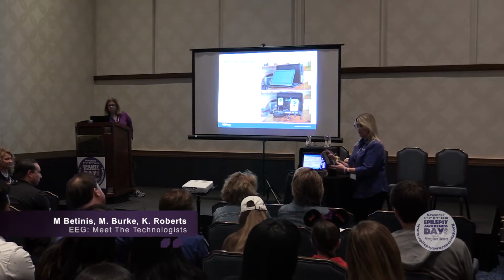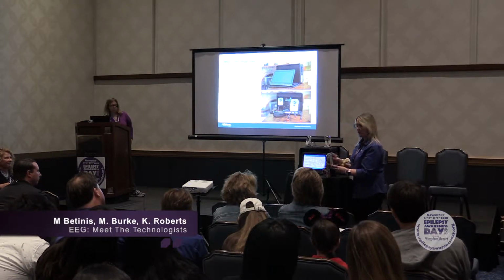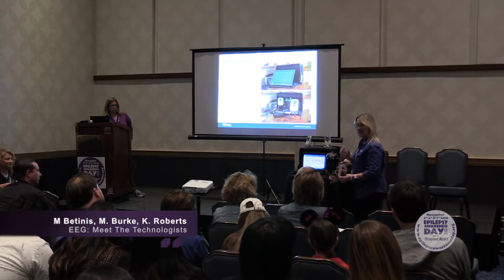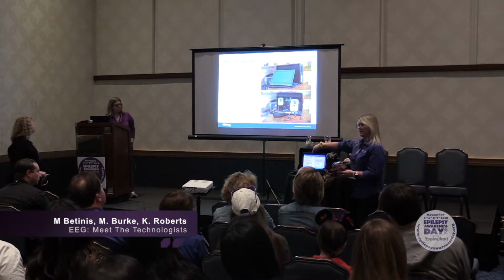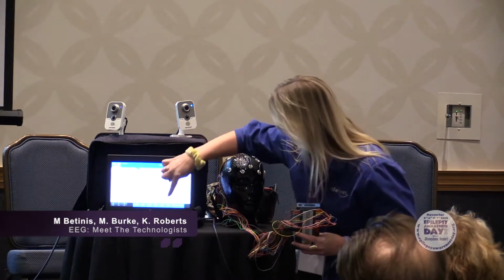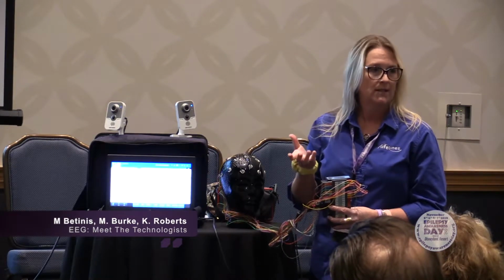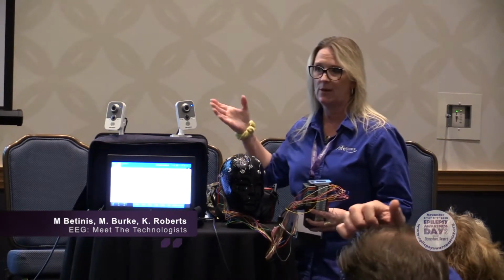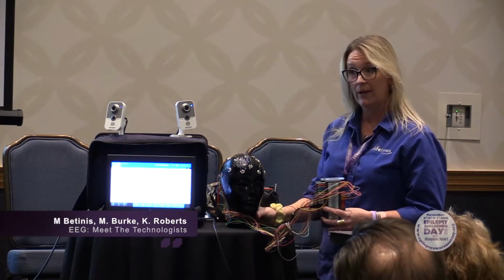This is our ambulatory recorder. It's quite popular and very well known for probably the past 18 to 20 years in EEG, which is pretty long. And you would wear this either on your hip or in a little backpack. And let's say you have an episode. There's a button here that you press, and it'll mark it right on the EEG. The other thing that a parent or the patient can even do is they can annotate just by touching the screen what their symptoms may be, or that they're going to sleep, or they woke up in the middle of the night and they feel like maybe they had an episode, and you can even talk and say what your symptoms are because you're being videotaped. So then the neurologist can go back and decide what's going on with your brain waves during that time.